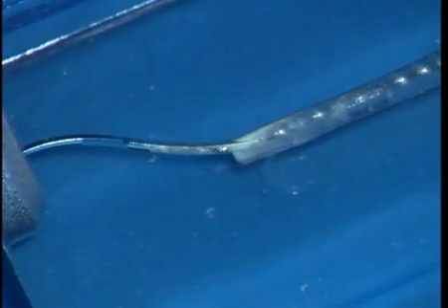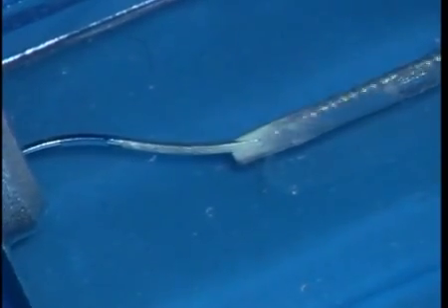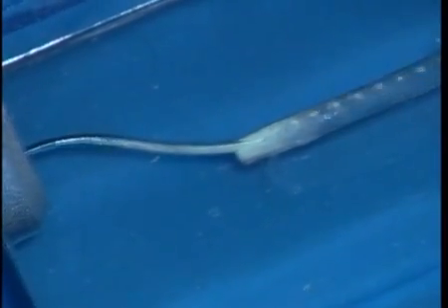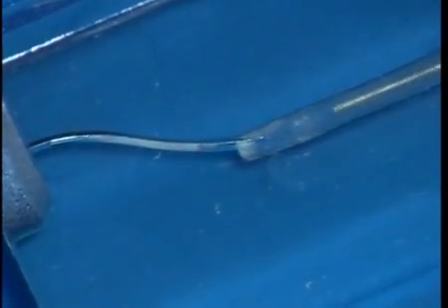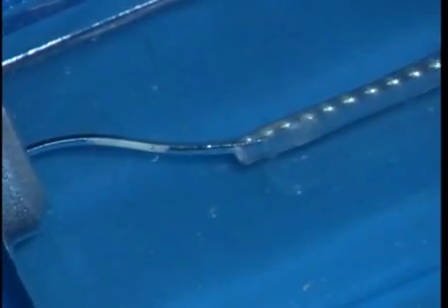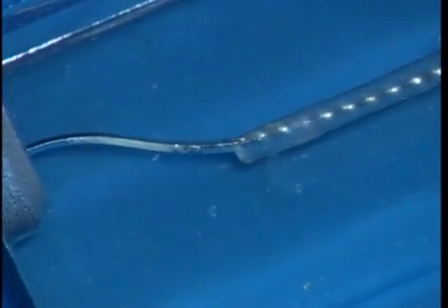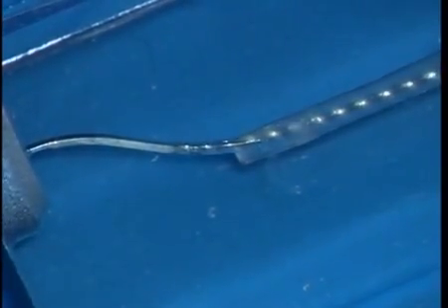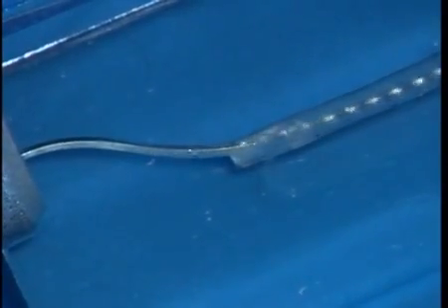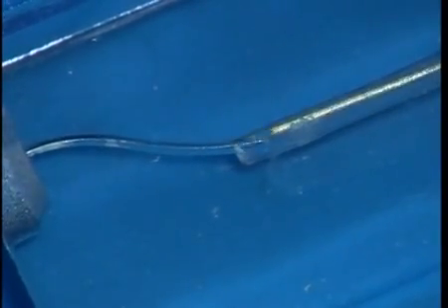apical. With a little bit of orientation, the file readily drops through the debris, and again the short amplitude strokes move a lot of this debris into solution. Irrigate, recapitulate, and re-irrigate. It's important when pre-curved files are placed apical to the ledge to stay at this position and work the instrument deliberately and repeatedly, because this procedure refines and expands the glide path and makes it easier to introduce progressively larger instruments.